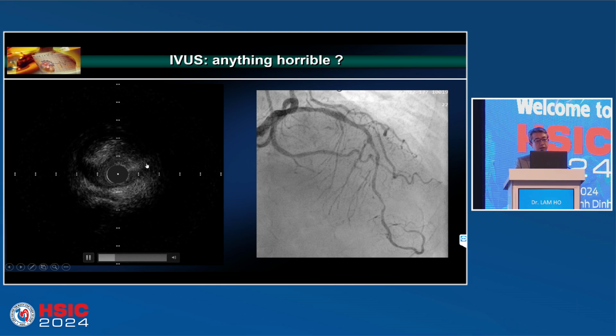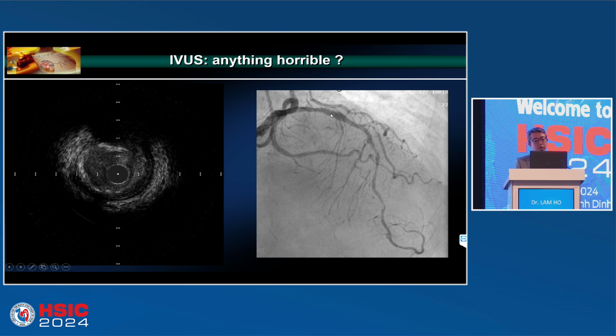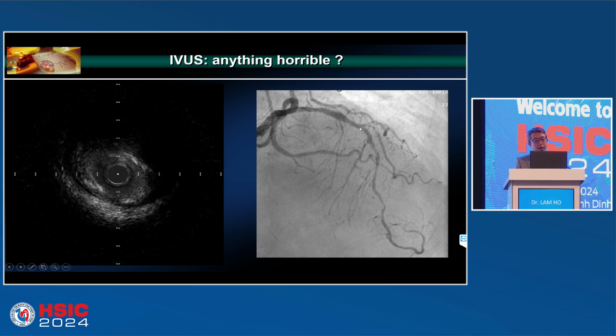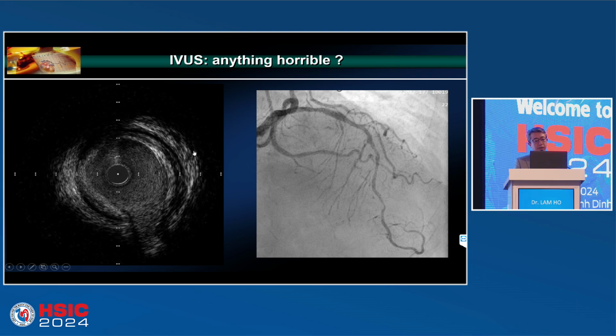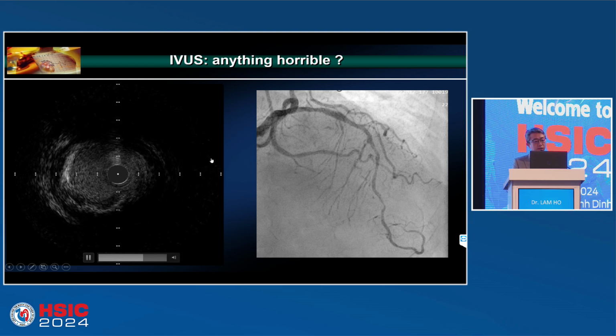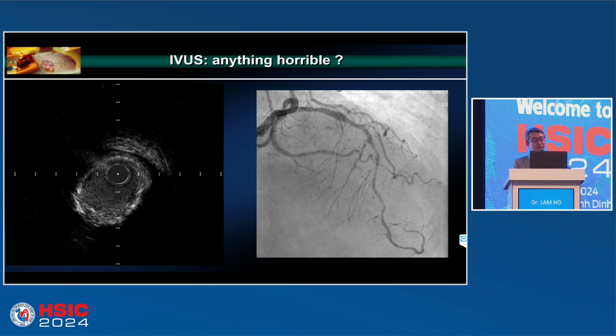Plaque burden was very heavy, but nothing special. It's just as usual. We know the plaque burden is heavy, lots of plaque. You know, there's an aneurysm, so we will shortly go to see. Probably we are somewhere over here. And then it's manual pullback. And then here is the aneurysm. So here is the aneurysm part. Further pullback is to see the lesion over here, over the proximal LAD. So let's see. Okay. Do you see anything horrible?